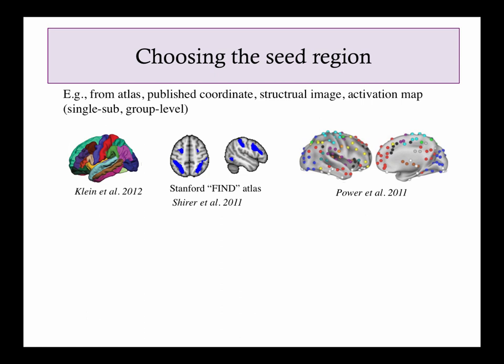The seed-based analysis is very straightforward, but it does require us to choose a seed. And so where are we going to place it and what size should it be and so forth. And so we're faced with the same concerns that we are when we try to do any kind of ROI-based analysis. So this should depend exactly on what you're studying or how specific your hypothesis is.